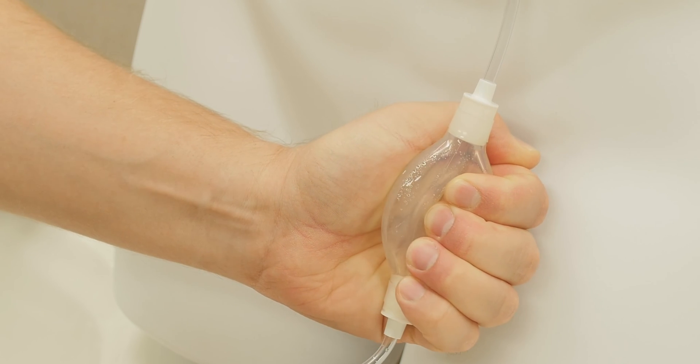It is important that you know how to drain and care for your catheter. You should have been given personal step-by-step instructions by your healthcare provider for this care. This video presentation is designed to help review these steps.